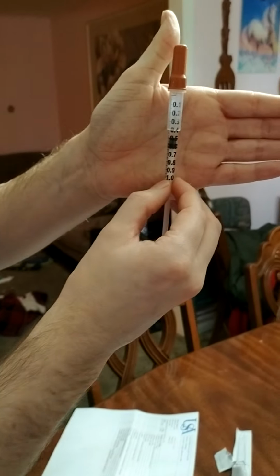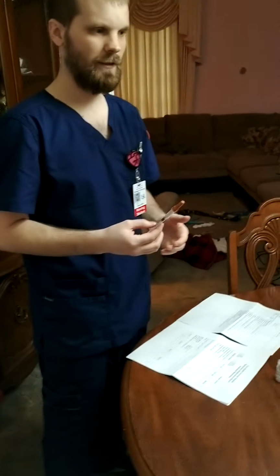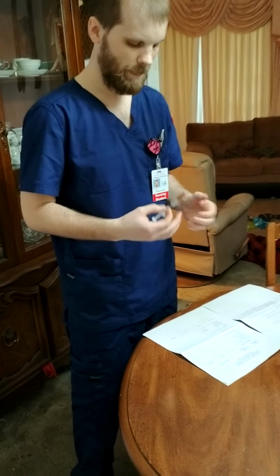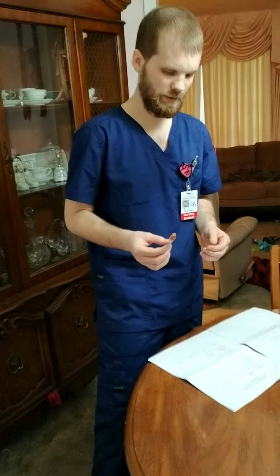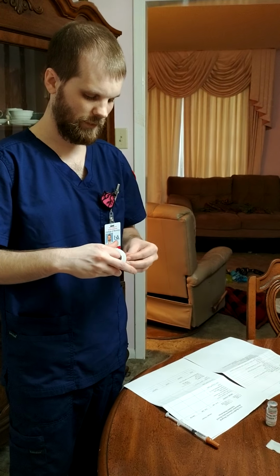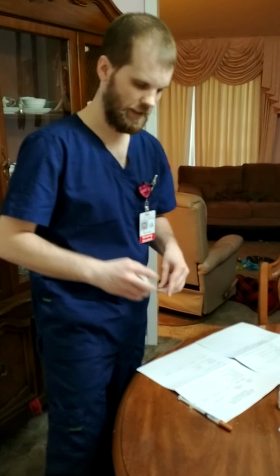And I have 0.5 mLs. I will get another nurse to verify my calculations for the amount being 5,000 units. Since there are 10,000 units in the vial, then it'll be 5,000 units or half an ml. And I will have them also verify that I have the correct amount in the syringe. I'll then make a label for my syringe with the patient's name, the medication, and the amount of medication to be given.